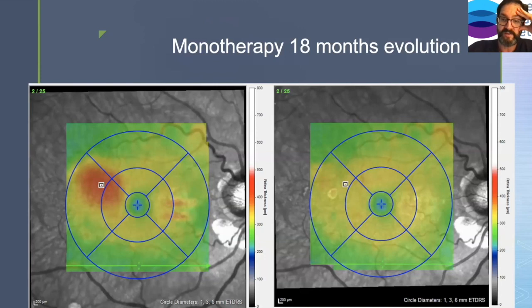There's another point of this, which is, point number one is compliance or non-compliance in long duration therapy. The other one is kinetics. When you're used to using anti-VEGF therapy, you're used to having a quick response, like within weeks. So MicroPulse laser does not work that way. Even though I've shown you a patient that improved in a month, the majority of patients will improve over the course of 3, 4, 5, 6 months, a gradual process. And you need to know about that.